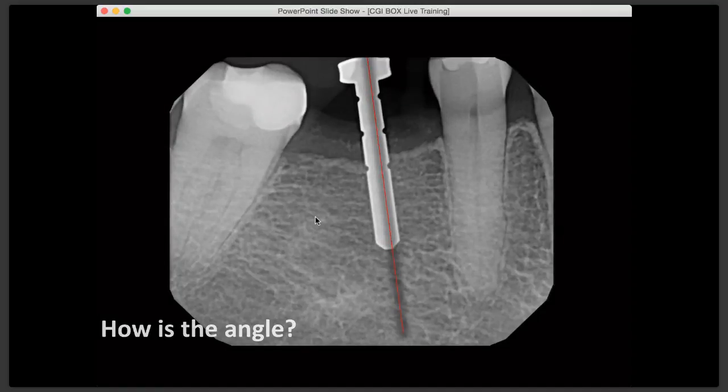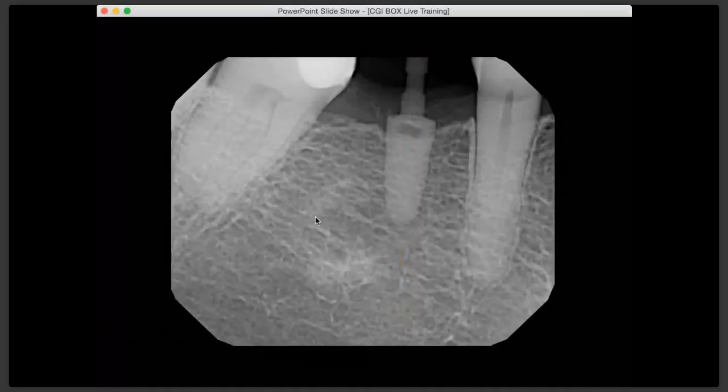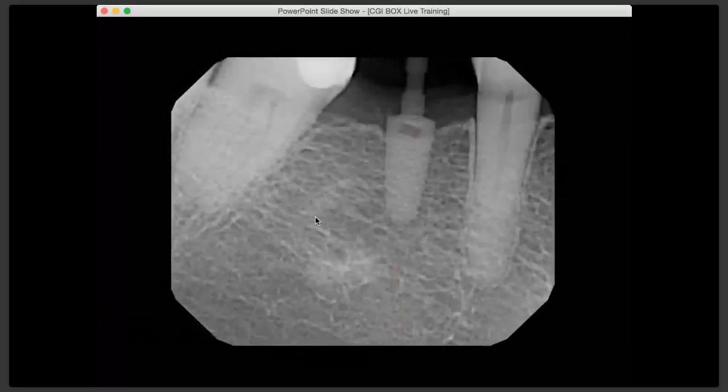At a different angle x-ray, okay, it looks pretty good. So my message here is, don't just look at an x-ray. You know what, I don't like the angle, let me change it, because the x-ray may be wrong, because the second molar is significantly mesially drifted.